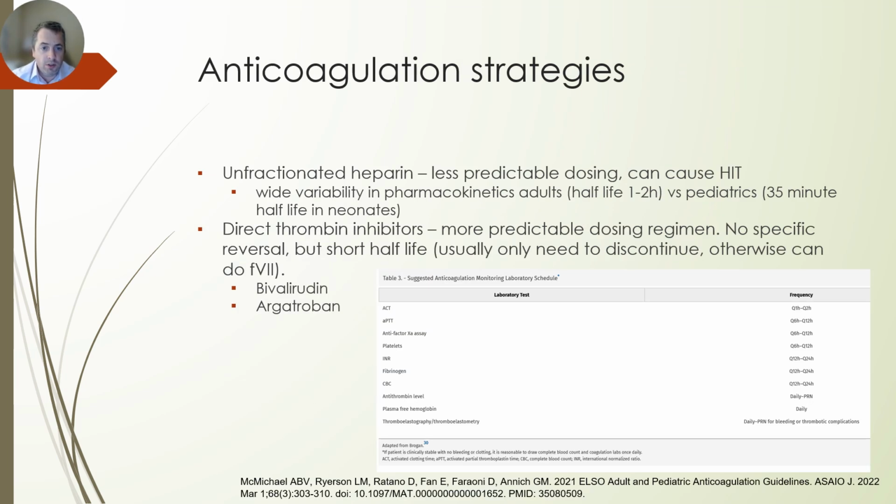If safe to do so, you're going to want to thin the blood in some way while on pump to prevent clots in the circuit and from spreading into the body. There are different strategies to do this. It was formerly unfractionated heparin, and that still may be your initial load. But this has less predictable dosing and wide variability in pharmacokinetics.